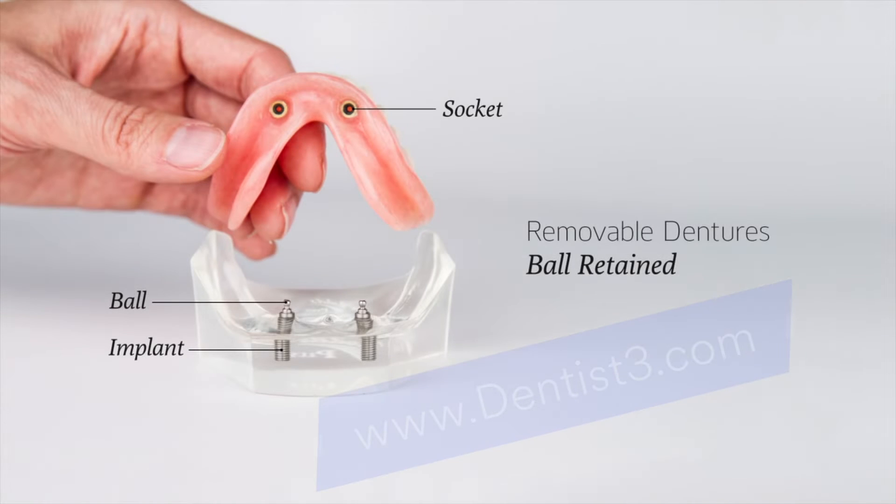With ball retained dentures, each implant has a metal ball shaped abutment which sits above the gums. Round sockets in the bottom of the denture are made to snap onto the balls.